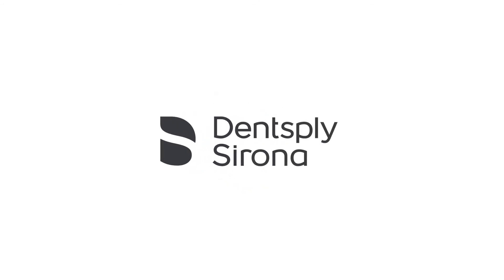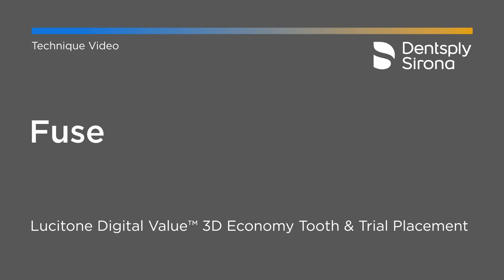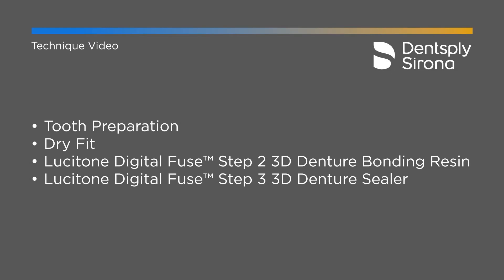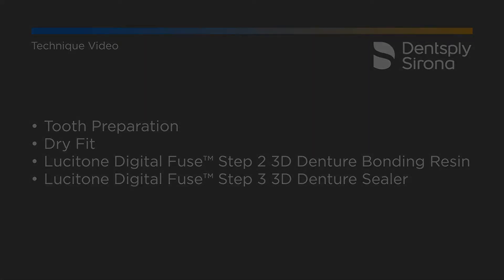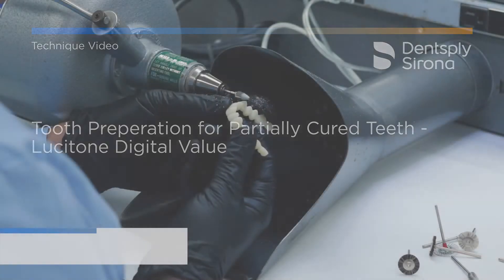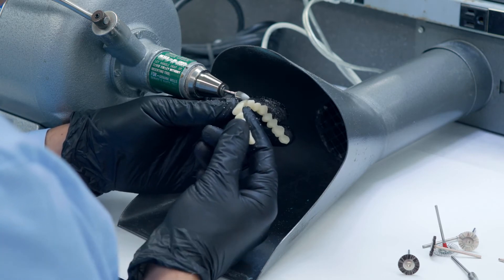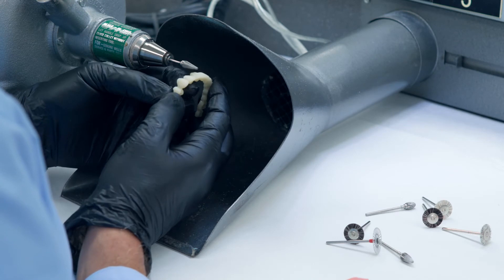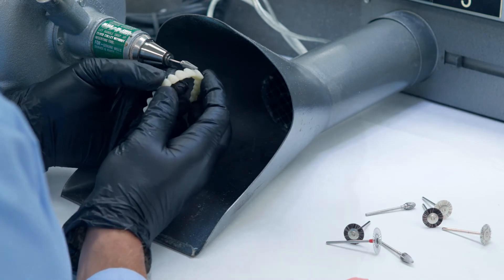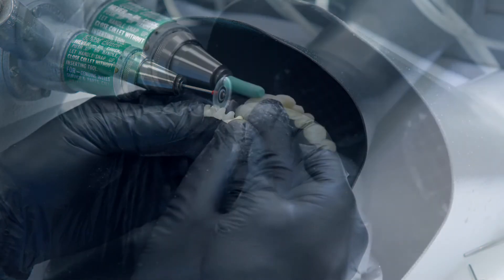The final offering from the Dentsply Sirona Lucitone Print System is when you're using a printed tooth like the Lucitone Digital Value. When fusing a resin to a resin, you are able to skip Fuse Step 1 — the tooth conditioning agent. Do not apply Fuse Step 1 to the Lucitone Digital Value, as it would essentially melt that material in its raw partially-uncured state. Polish any support sprues off using a diamond disc to ensure the proximal area is adequate for seating, and then polish, shape, and contour those teeth as needed.